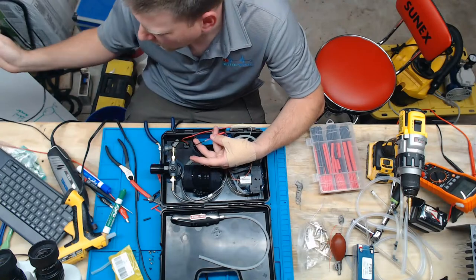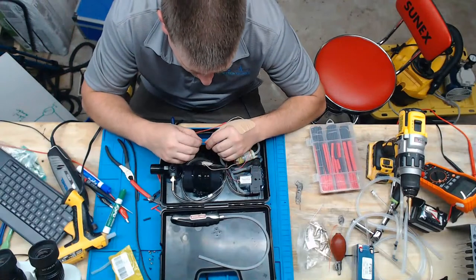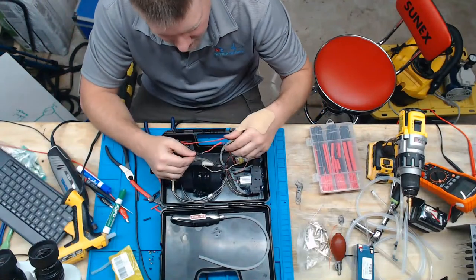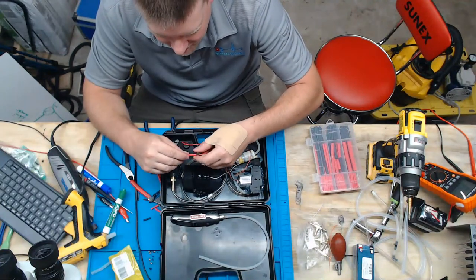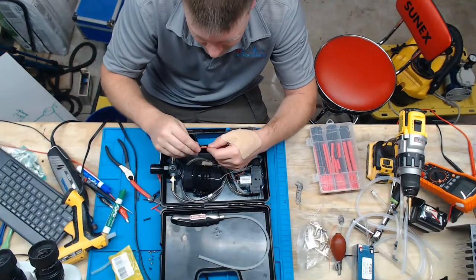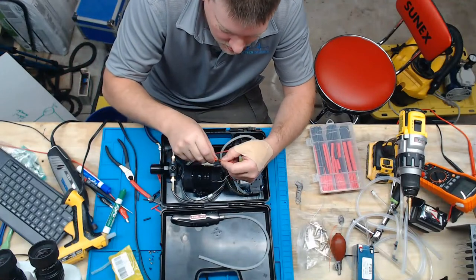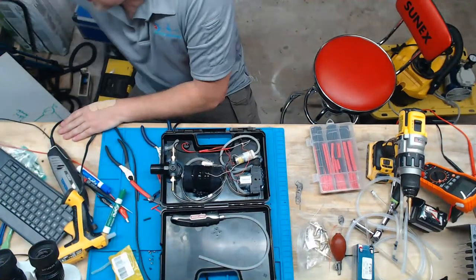And you see, I always blow on it. I blow on it to hurry up and cool down the joint, because you don't want those wires to slip off. Especially if you got a big old hot ball of solder on there, it could go flying. I know, guys, I'm supposed to have eye protection and stuff, and I do have some here. I'm such a bad example.